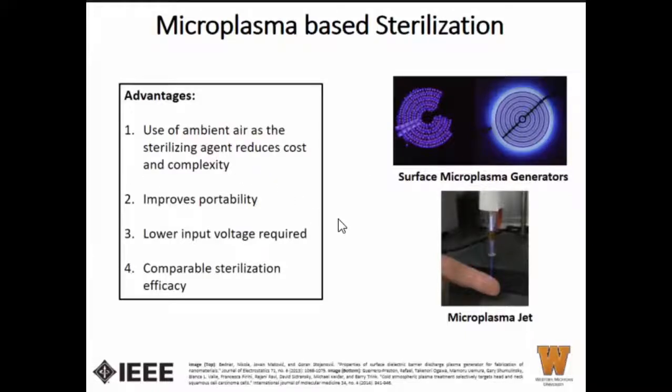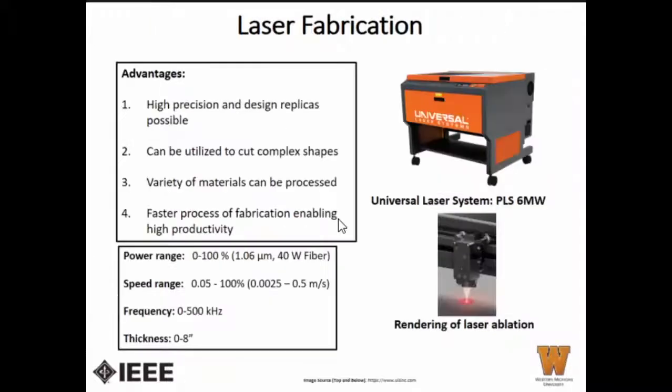For this, if we use microplasma and we don't use any chamber, we will improve the portability. Since it is microplasma and non-equilibrium, we will have a low input voltage, and we will show that we have very comparable and in some cases amazing efficacy in terms of sterilization.